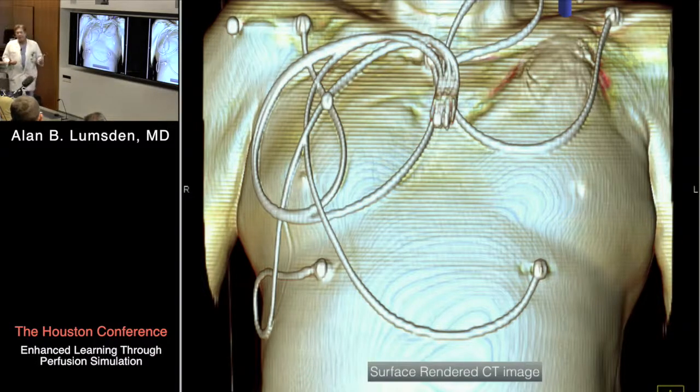But if the patient's got a CAT scan, we need a way, and the neurosurgeons do this every day. If you walk into a neurosurgery operating room, they have an advantage. They put bolts in your head so you can't move. But Medtronic makes this system, it looks like E.T. It's got this arm on it and it looks like eyes coming off the top, and they scan the head. And then they fuse these images together, and they plan how they're going to navigate inside your head based upon that. And a lot of these things have not made the leap into the cardiovascular world.